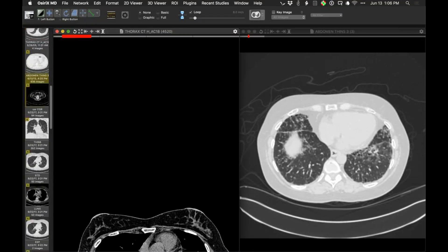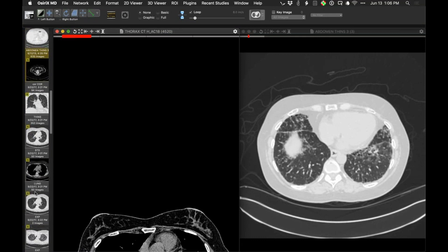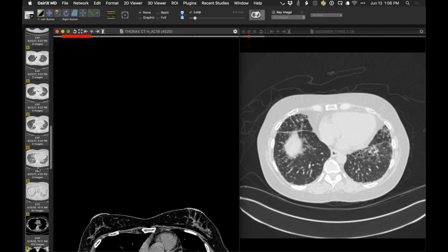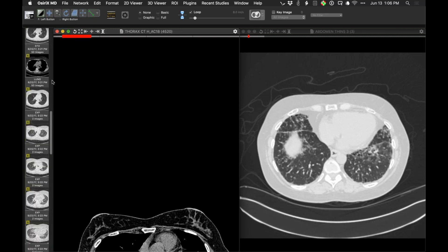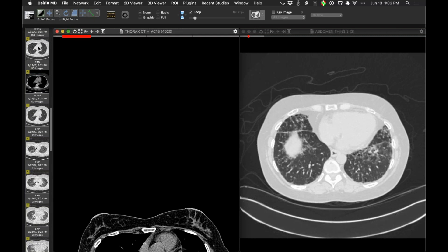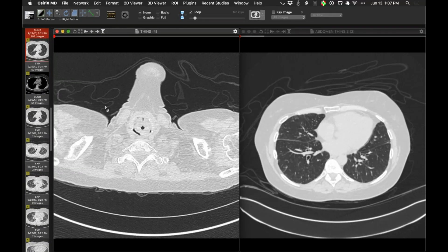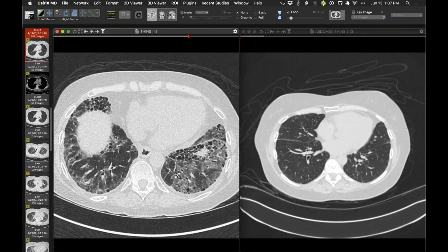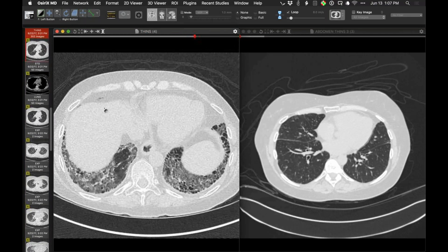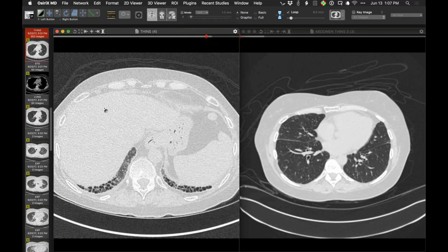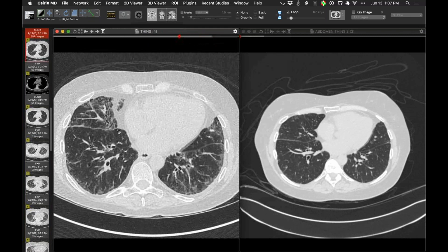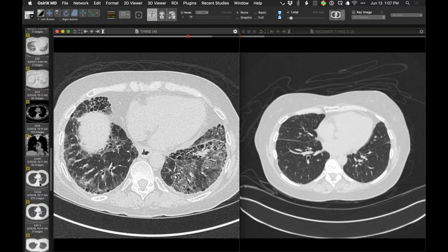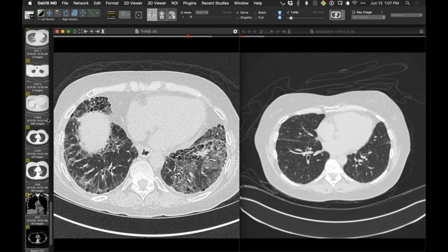Now bringing up 2017, about four years later. We still have disease in the lower lung zones with a lot of cystic change that doesn't appear very different from before, but there's a lot more ground glass attenuating opacity in the lower lung zones as well.